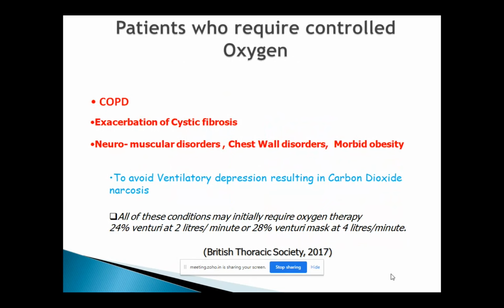So very commonly we may have a face mask, nasal cannula. If your hospital doesn't have these Venturi devices, I'm not saying you don't have them, I'm saying if you don't, it may be the right time to talk about this to your managers and have this equipment available to provide the right amount of oxygen to your patients.